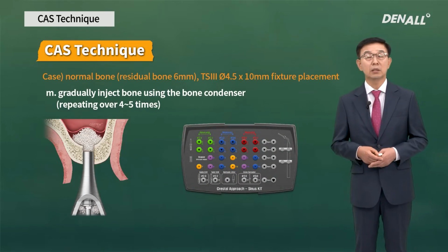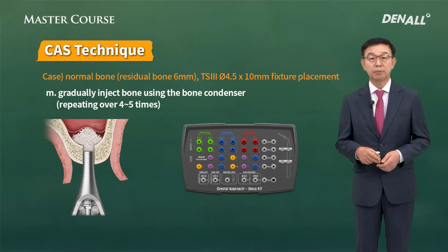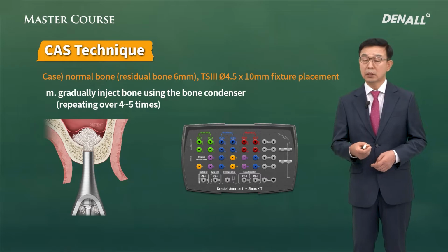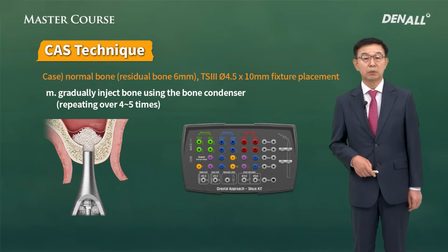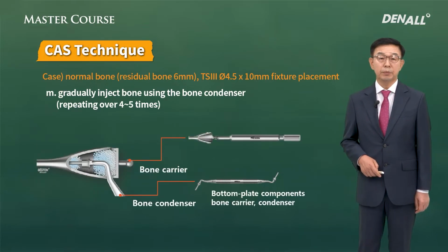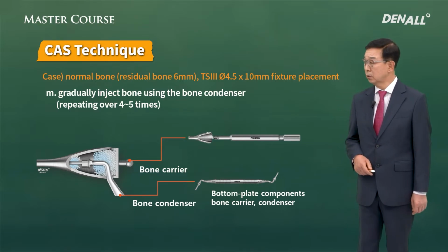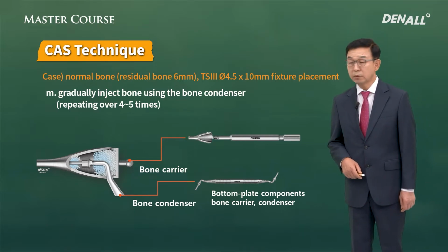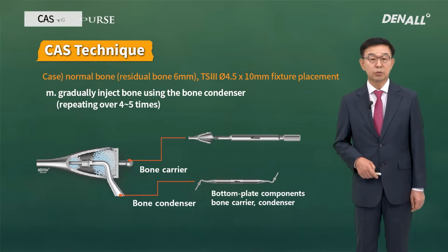Finally, always pull to remove the saline and the sinus. You need to do it fully. Bone graft should be done and implant should be placed. In doing bone graft, there are tools for bone graft. There's also syringe type bone, and using that you can do it quite simply.